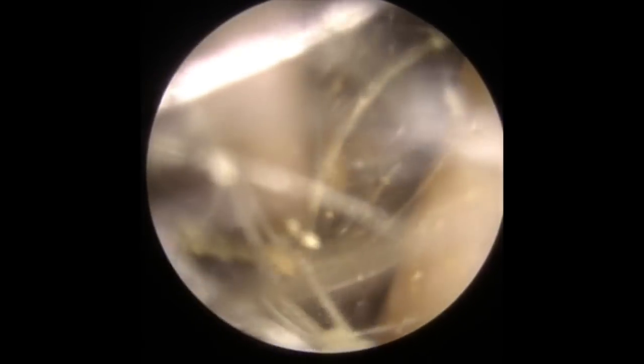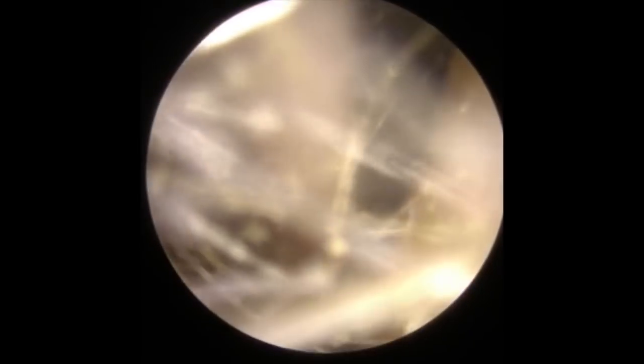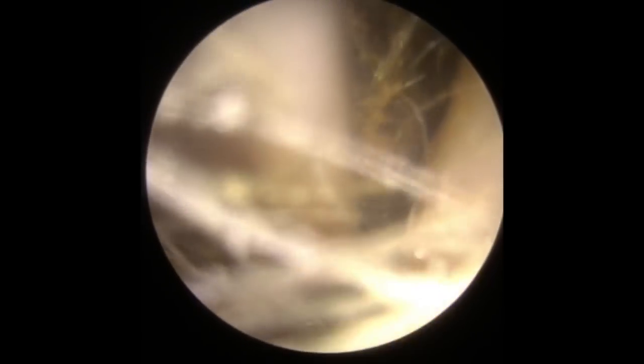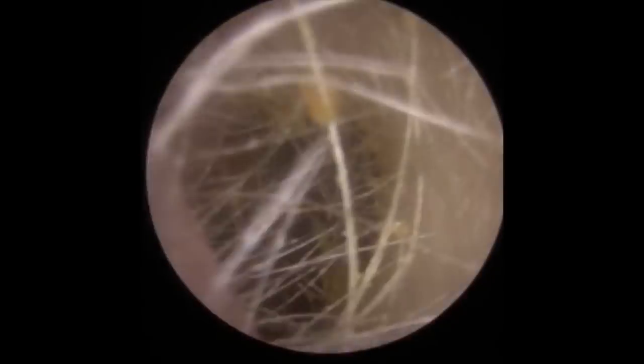As you try to pull this out, what's going to happen is this wax is going to start sticking to the canal walls on the way out. So what we're going to try and do is manoeuvre it around to unstick it from all the canal walls first, and then try and take it out in larger pieces. You can see we've got a bit of movement to the top, so we're concentrating our efforts there first. Can you see how sticky it is — it's almost like a crumbly stickiness, a really strange consistency this type of wax.